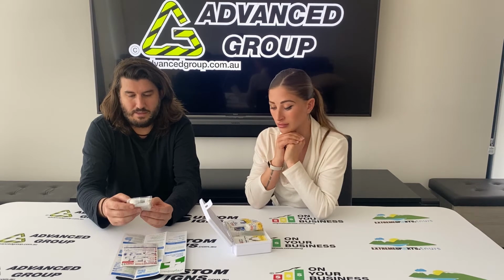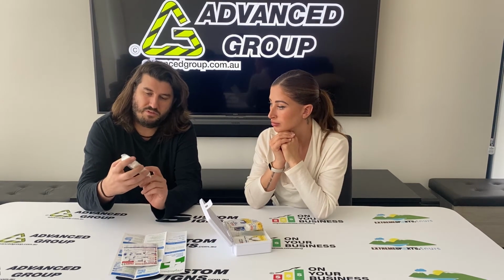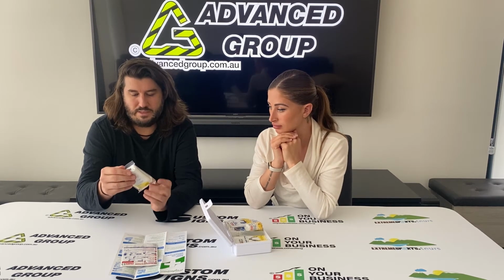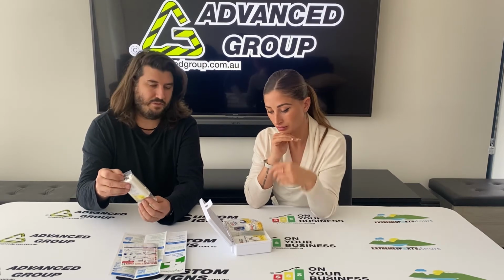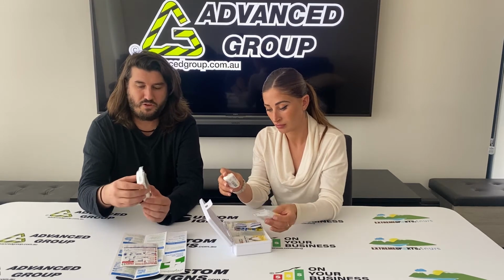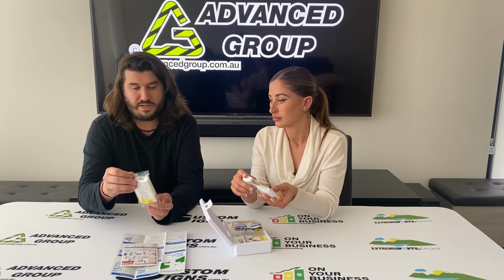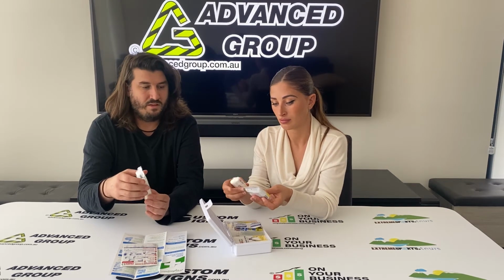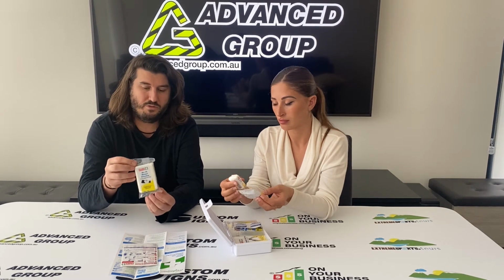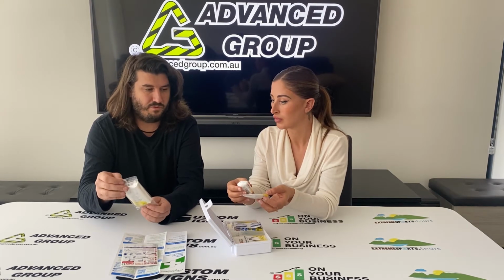Okay, so this is an example of something that's been sterilised. Single use, obviously. Yeah. Some little instructions on there. If you are trying to look in here to figure out what to use, you might not even necessarily grab the right thing on the first try. So I wouldn't even worry if you accidentally unpackage the wrong thing. It's important that the person's bleeding gets stopped, obviously. So if this is the wrong bandage for what you're trying to achieve, don't worry, just open up whatever you need to open up to make sure that person is well looked after.